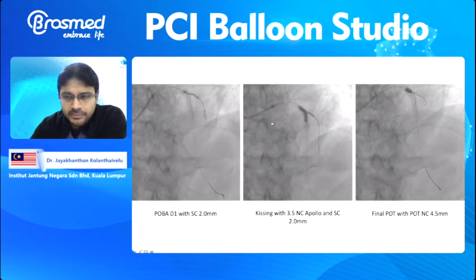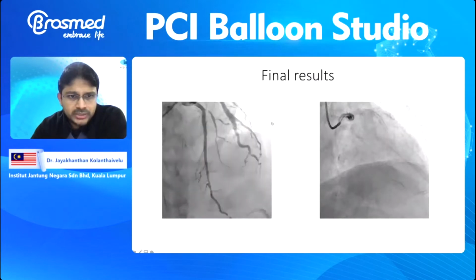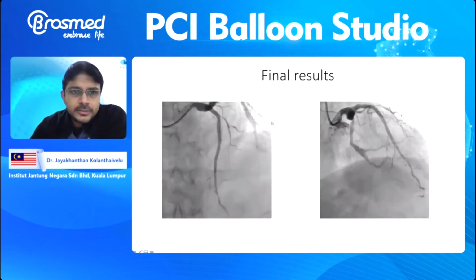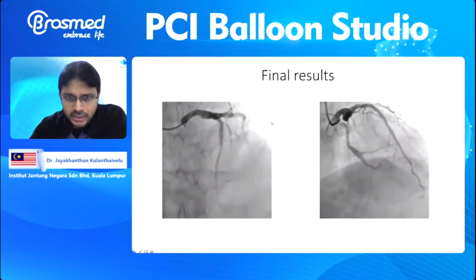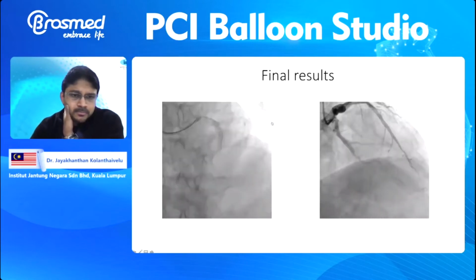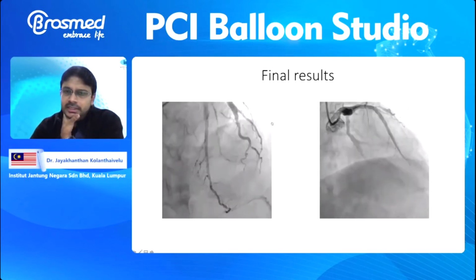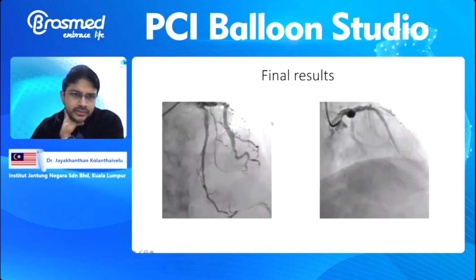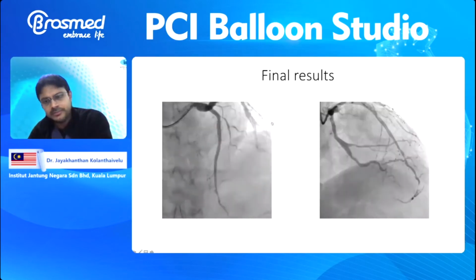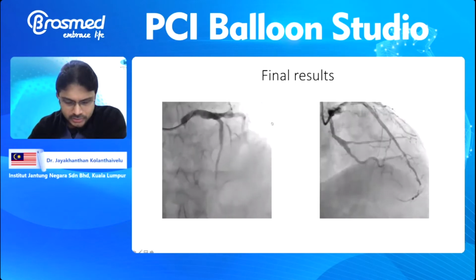And then POT to finish up. We thought the results were fairly decent, and the patient has been doing well since. So the POT balloon is very interesting. I kind of like it, to be very honest, because I think it's a better POT.